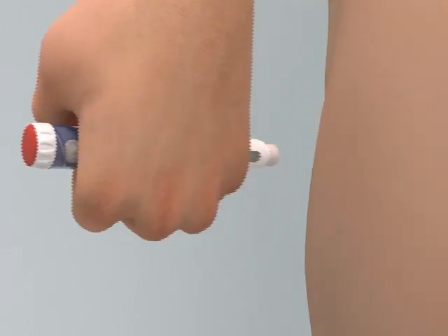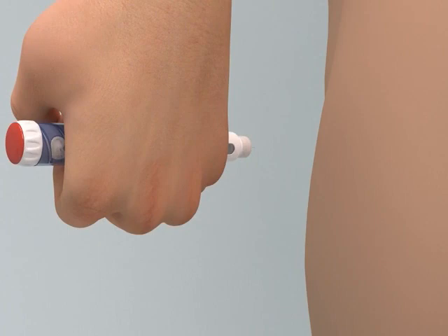Remember to remove the pen needle from the pen as described in the next section of this video after each injection. Leaving the needle on the pen after an injection may result in a few drops of medicine dripping from the pen.